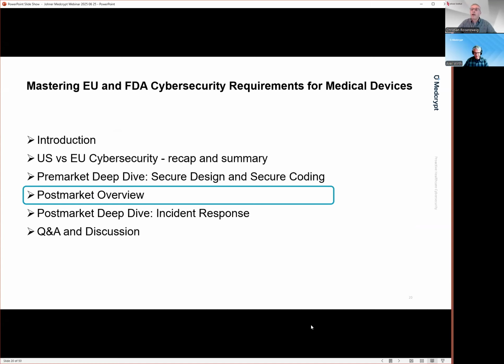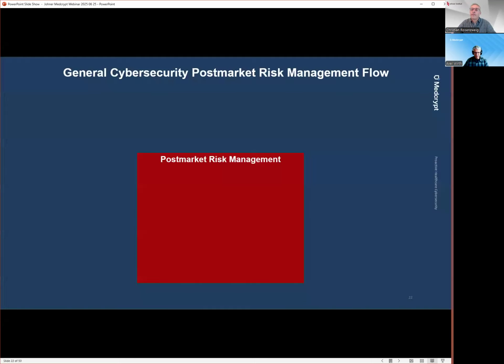Specifically post-market, what does your overall post-market management plan look like? What should it cover? Obviously, the basic concept is that you need to have a post-market risk management plan in place. You collect cybersecurity signals from various sources, including your supply chain, right? You have an SBOM, you monitor software components for vulnerabilities, you listen to your suppliers and look for notifications. You may sample and test and all those types of activities.